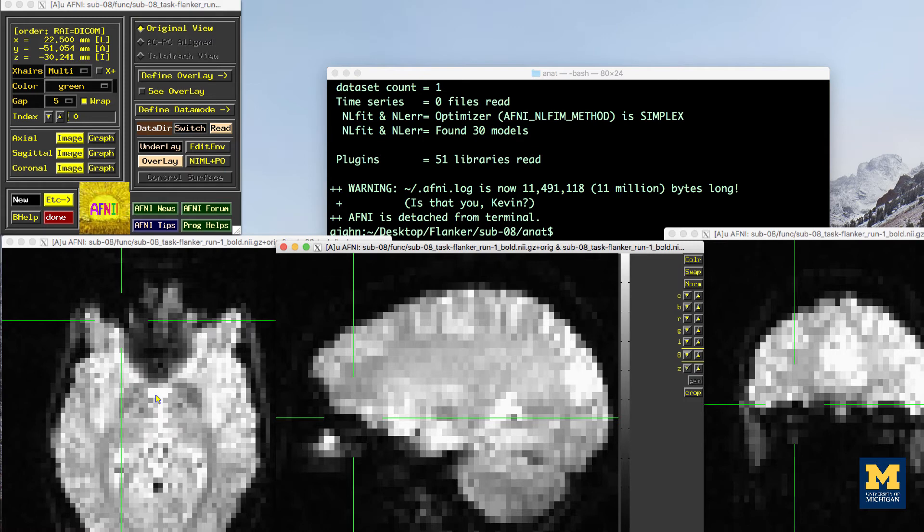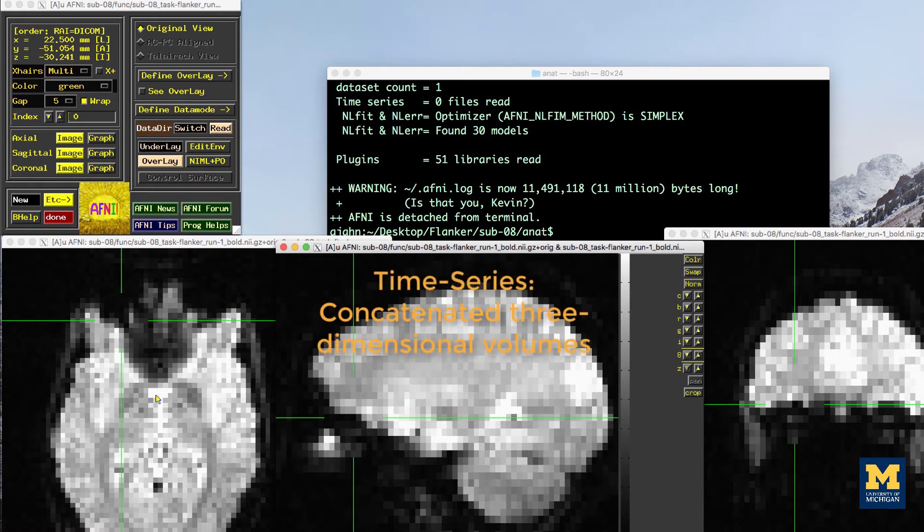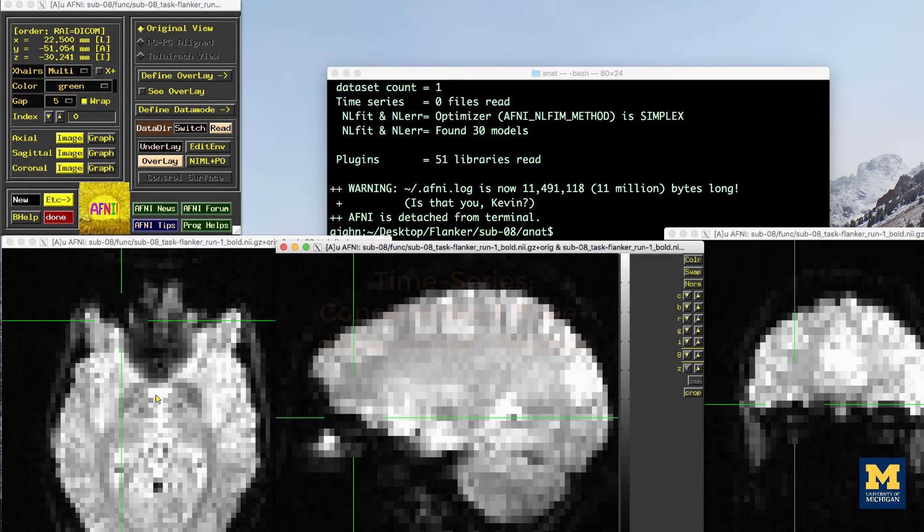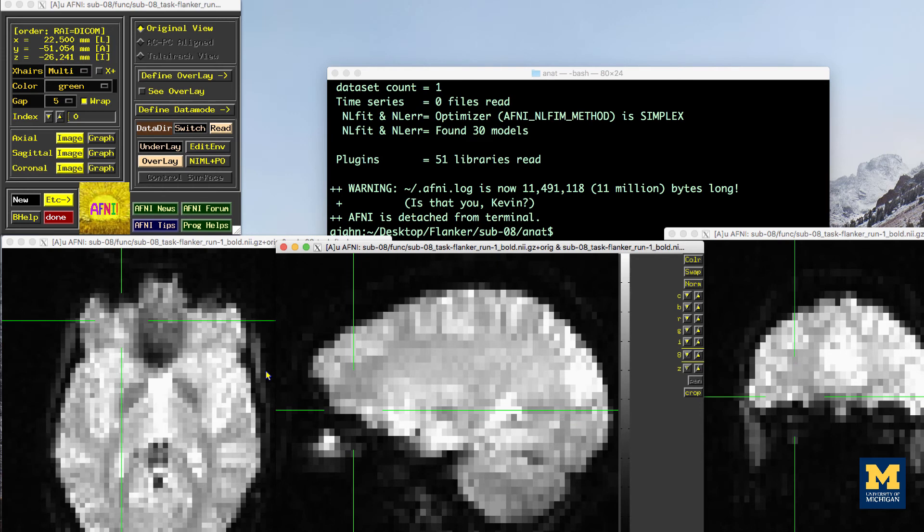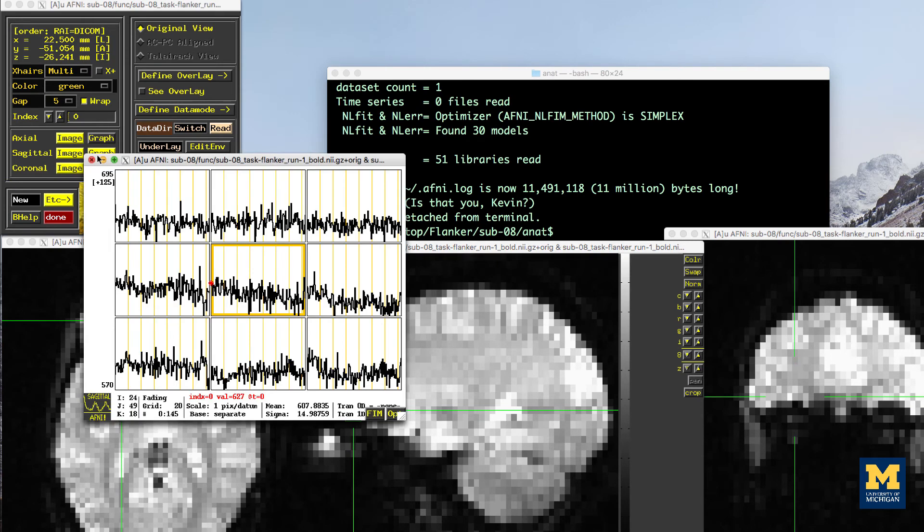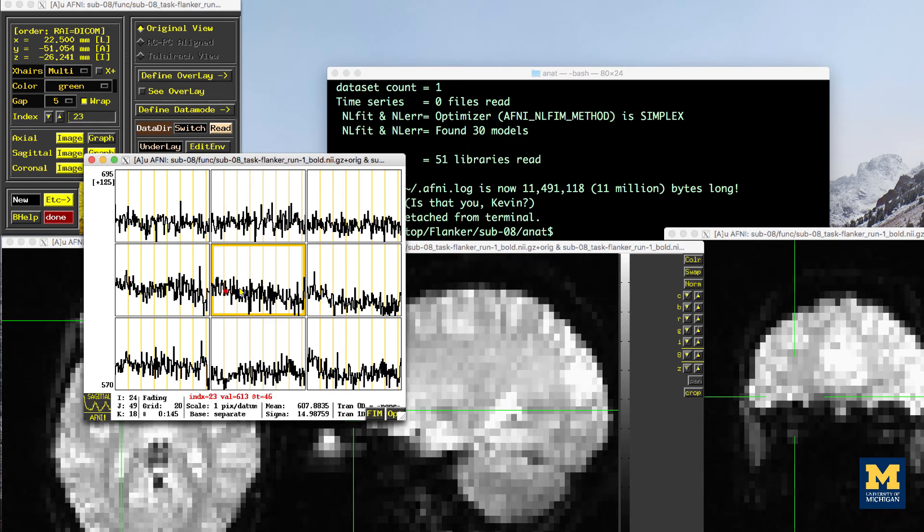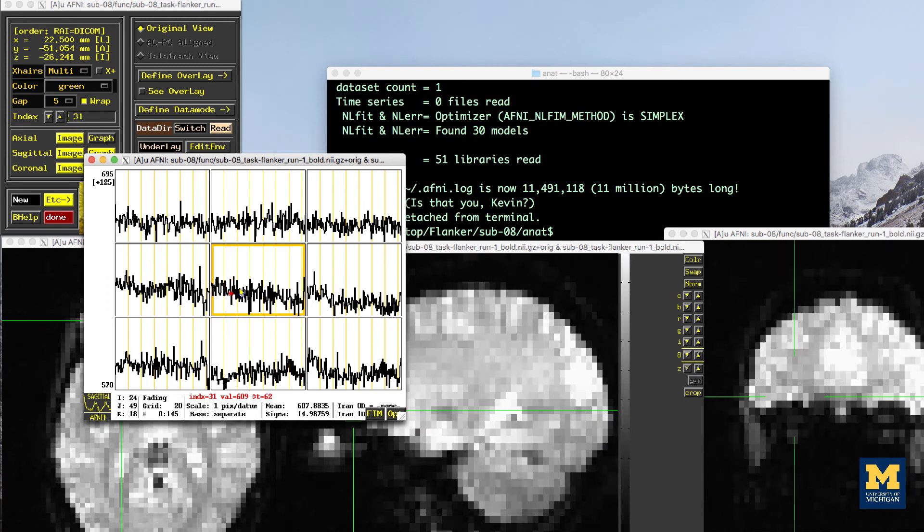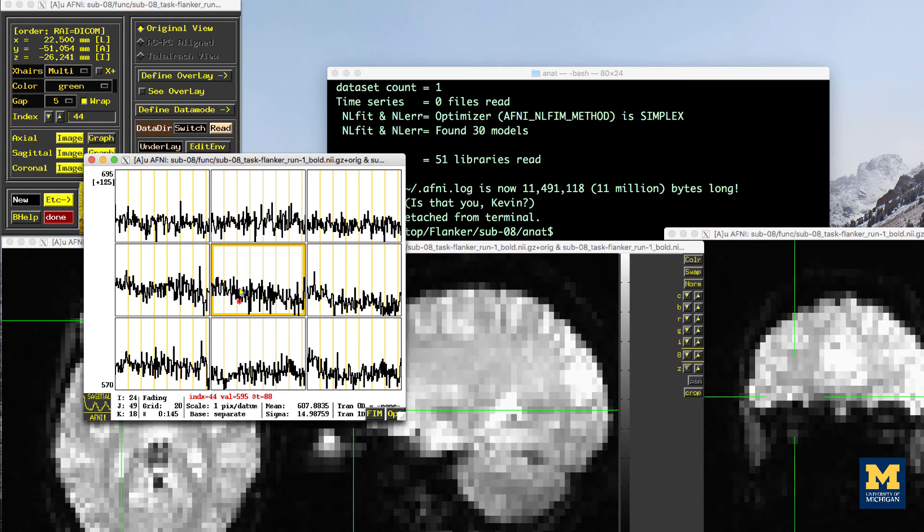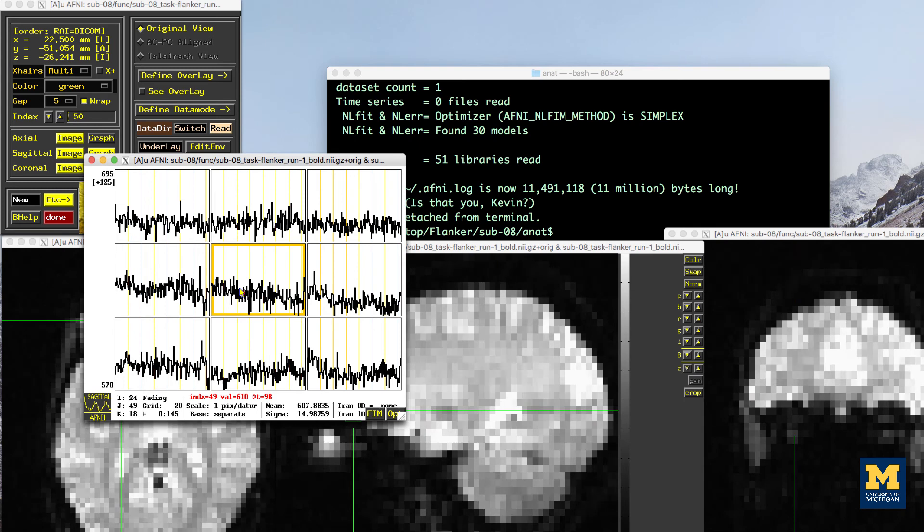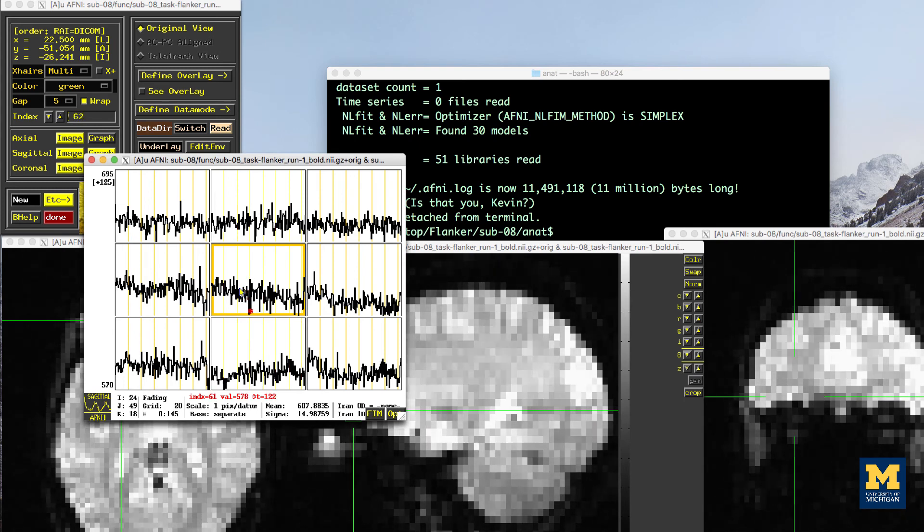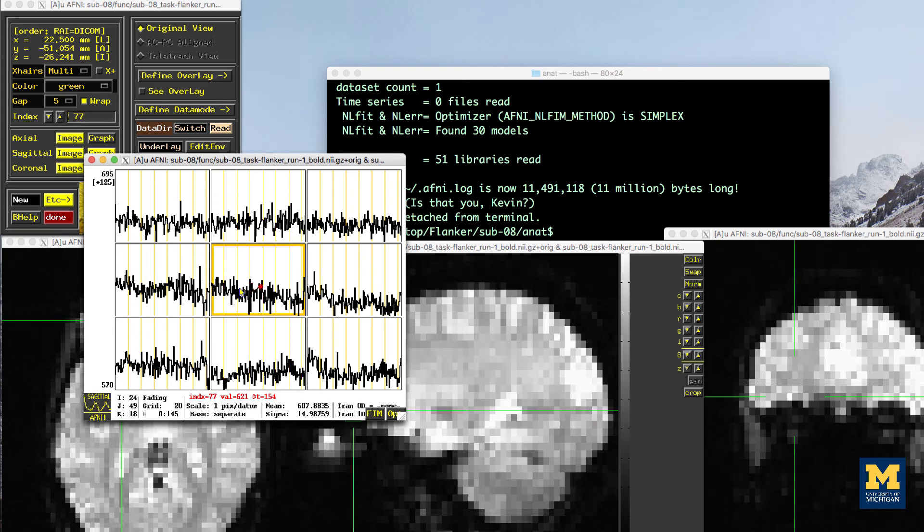Another quality check is to make sure there isn't excessive motion. Functional images are often collected as a time series. That is, multiple volumes are concatenated together into a single data set. You can rapidly flip through all of the volumes, like pages in a book, by clicking on the graph button and then by pressing the V key. You can stop at any time by pressing the space bar. Note any sudden jerky movements in any of the viewing panes. During preprocessing, we will quantify how much motion there was in order to decide whether to keep or to discard that subject's data.